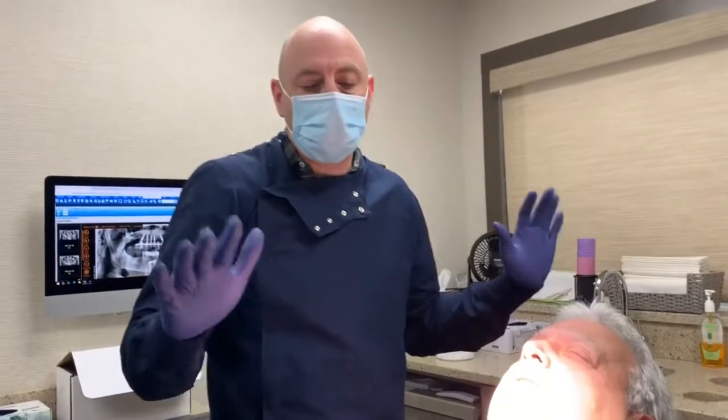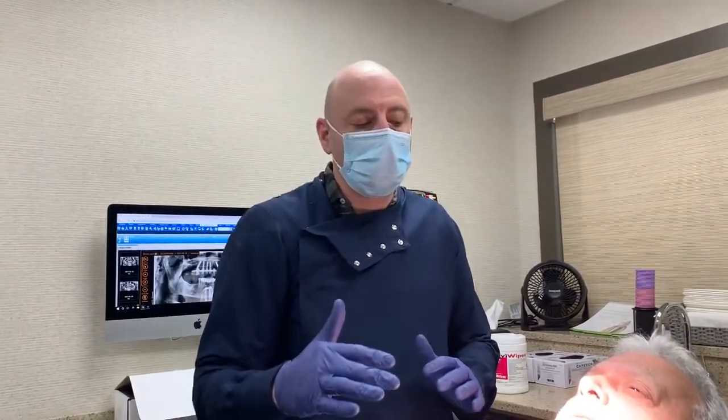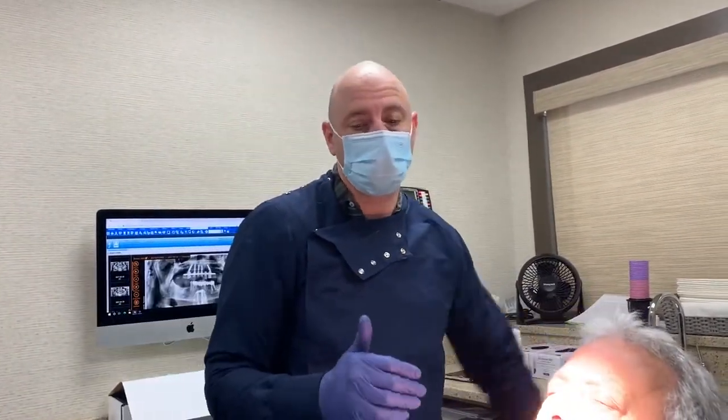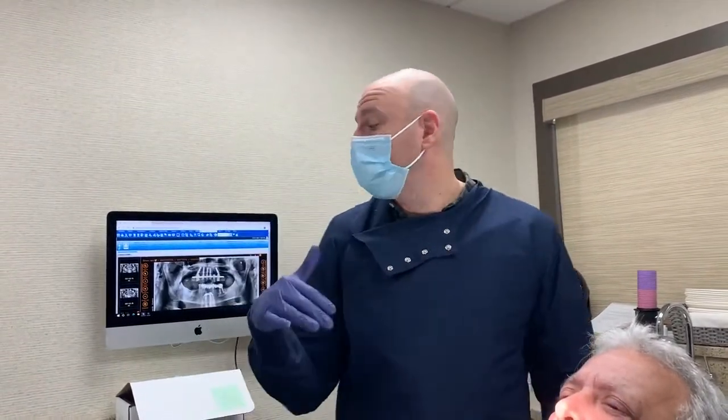I know that a lot of people like a group function. A lot of people will say, put them in canine guidance. Canine guidance is more for convenience, in my opinion. It's easier to put somebody in canine guidance than it is to put somebody in group function. But when you're trying to distribute the force, I like to put somebody in group function. So, what we're going to do, I just want to take an occlusal reg.